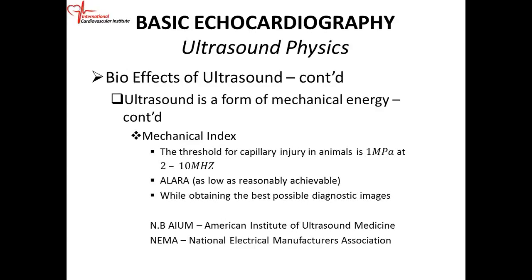And when we're doing ultrasound, you'll see ALARA all the time, or when you're doing any type of diagnostic or CT scan or whatever, you want it as low as reasonably achievable. You want to use the lowest possible settings to get the best image. You don't want to crank up everything because then you're going to run into a lot of side effects from the diagnostic study. So while obtaining the best possible diagnostic image, you want to do ALARA, as low as reasonably achievable. That's what that means.